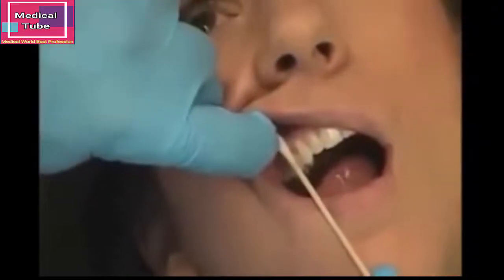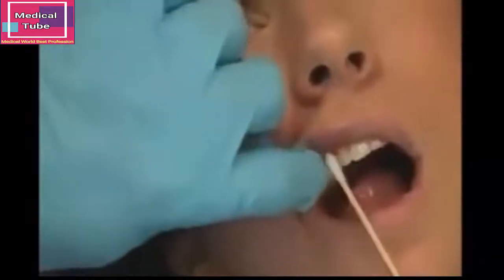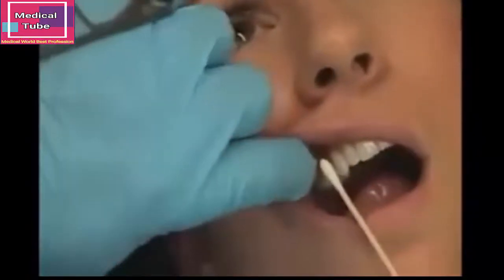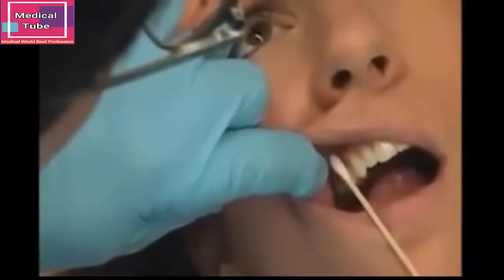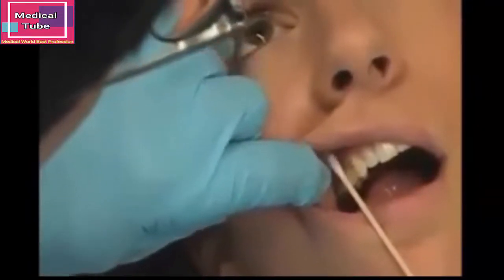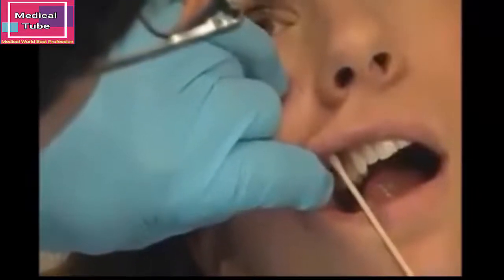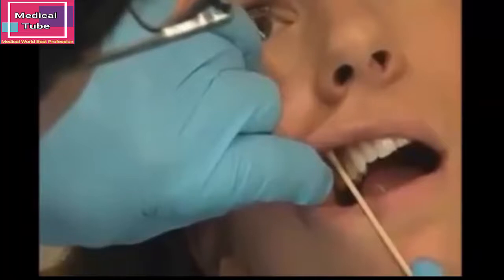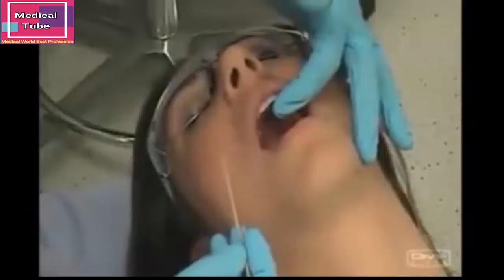Oftentimes with a little experience you can actually visualize where that is and fully concentrate on retracting the cheek and lip and then proceed to that intersection right here where we find the foramen. Go up until you contact bone, and there you are. This is the infraorbital nerve block.